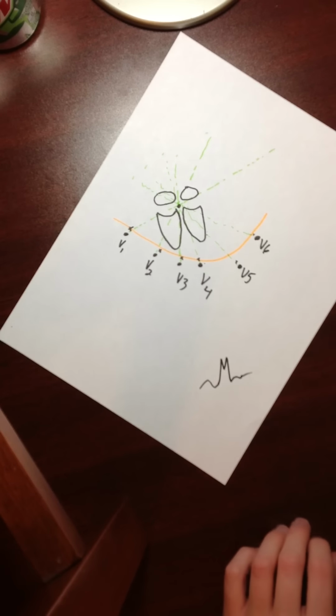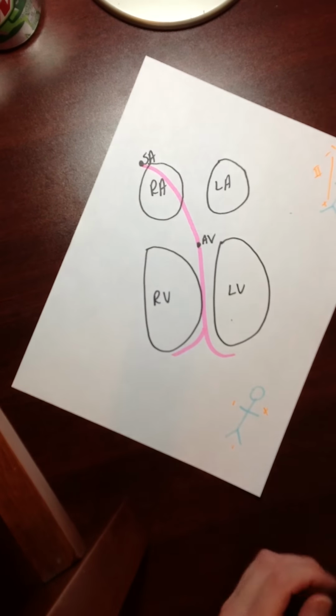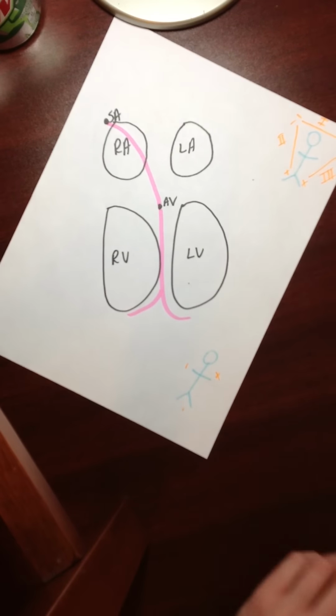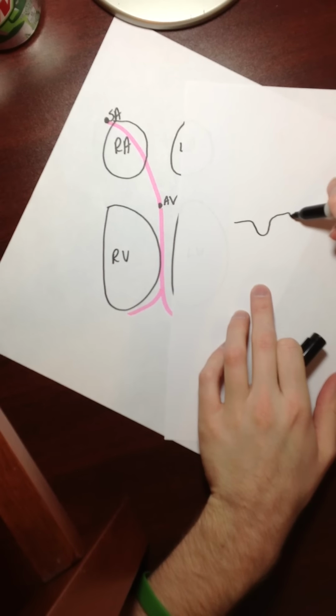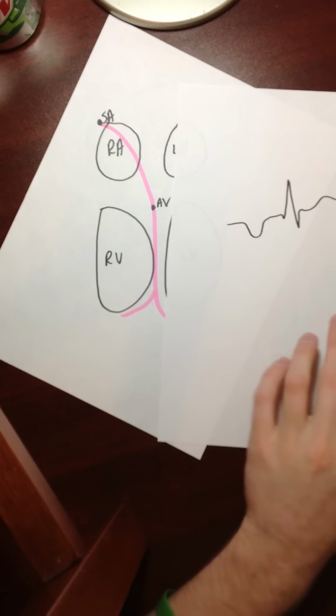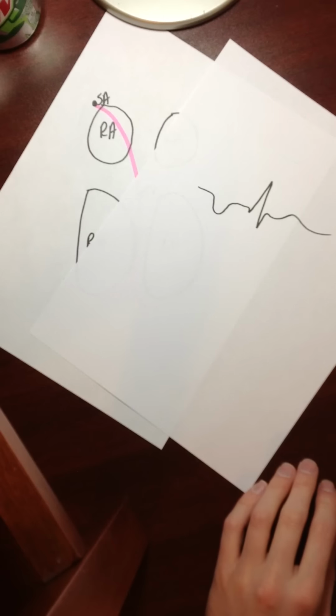The one thing I was going to do real quick is one kind of arrhythmia that helps explain the vectors anyways. So what could be a cause of having an inverted P wave? So let's say something that looks like this. Okay.